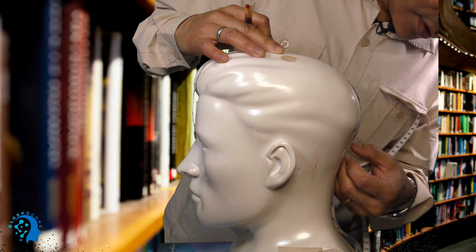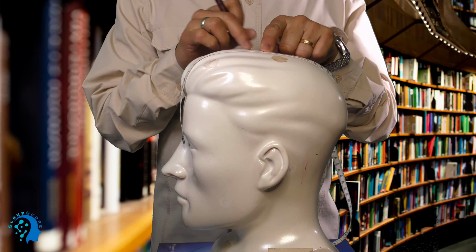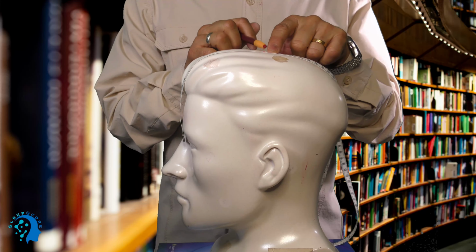On the back also you'll see I went like this. Here was the Inion, and then I go up 3.8. Normally when you do 3.8, that's the 10% from Inion and Nasion, we go up 10%, and from half, the easiest way is going 20% down, which is 20% of 38.